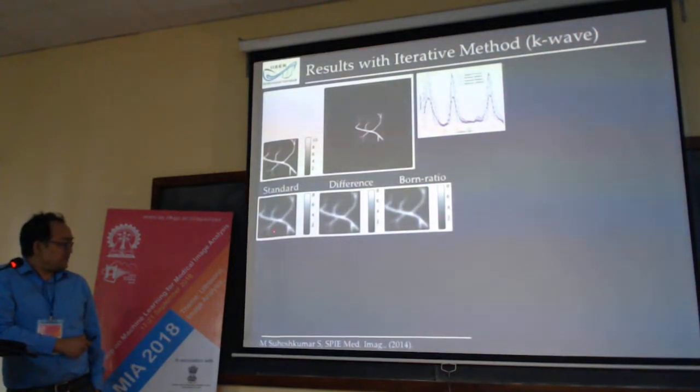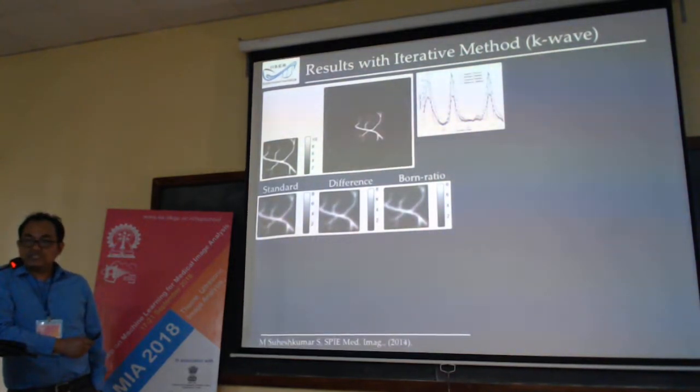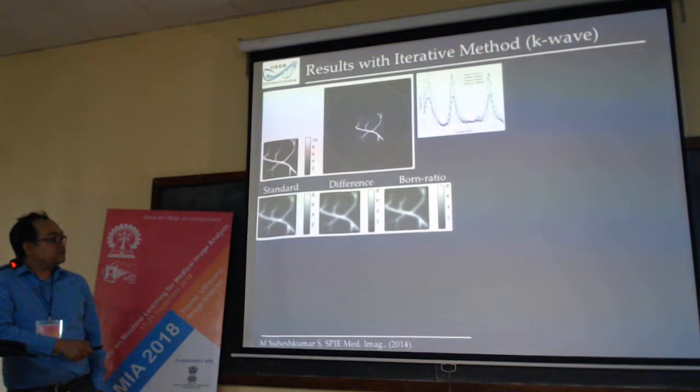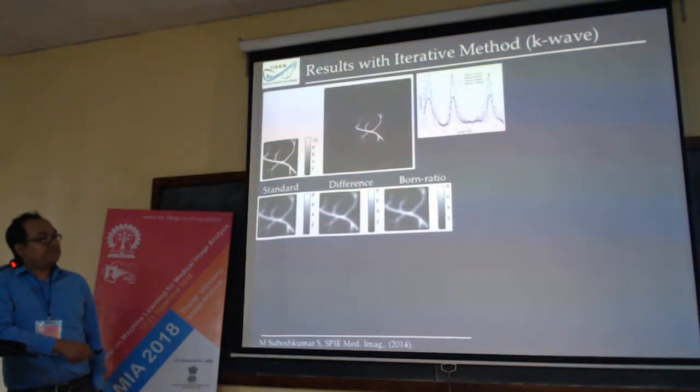This is the standard technique. Then there is the signal that we got from the background, and the signal that we got from the sample, and we take the difference, subtracting it out, considering that the noise from the background is additive in nature. The other approach considers it multiplicative in nature. We found that considering the multiplication, by dividing the signal from here by the background, gives a better signal. This is the characterization. We call it the ratio type data normalization, and that gives the better signal.